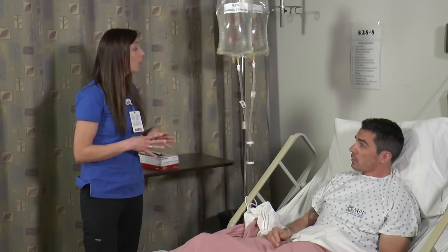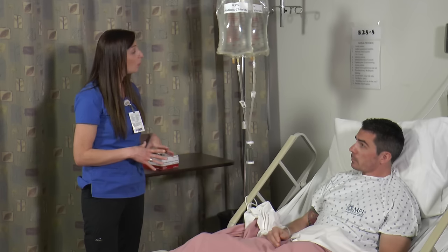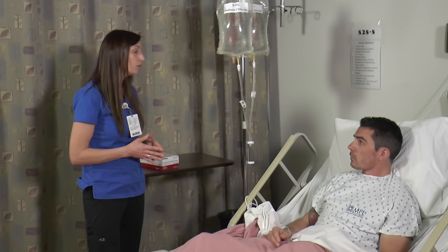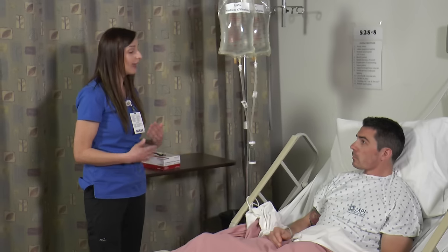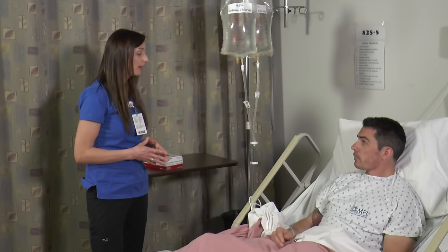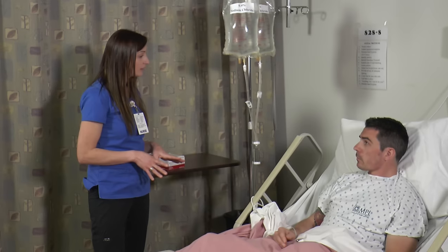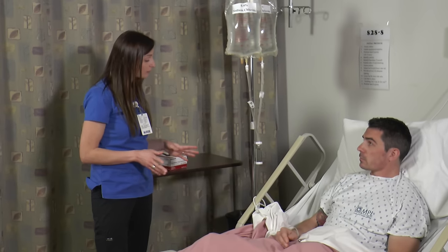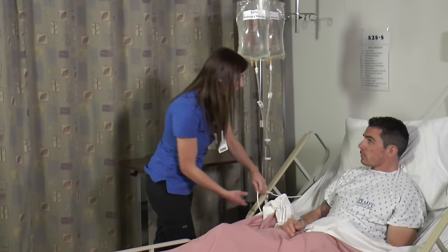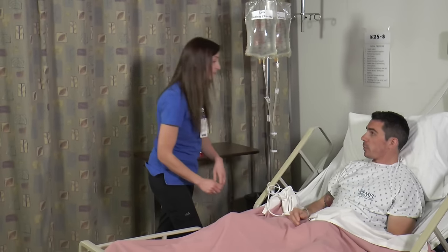So, I did speak to the physician, and I'm hoping that we're able to stop the continuous bladder irrigation because you are bleeding less, and hopefully you'll be able to go home today with the catheter in place, but not with these bags. And we will go over thorough discharge instructions and home care of the catheter before I send you on your way. That sounds great. Okay, so is there anything that I can get you in the meantime? No, I think that's all. All right, breakfast will be here, so let's take it one step at a time, and I will be back soon. Here's your call bell in case you need anything. Thank you so much, Megan. Okay.